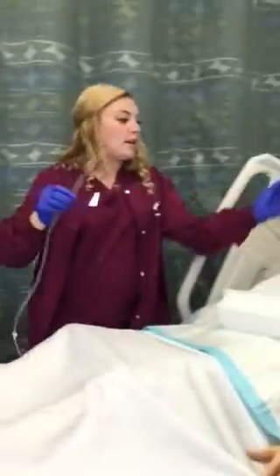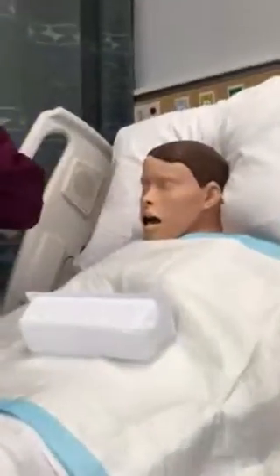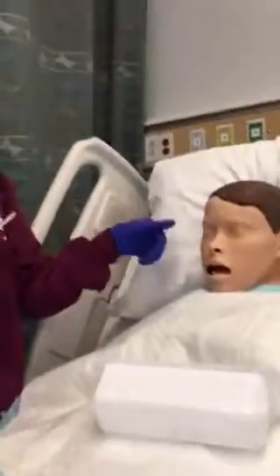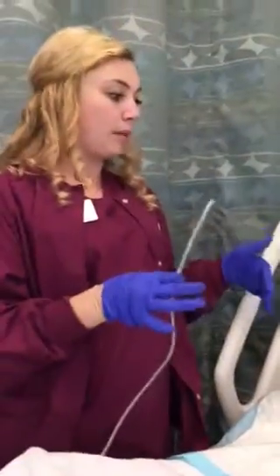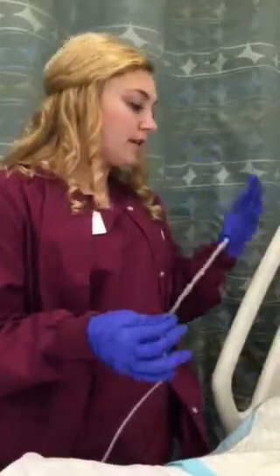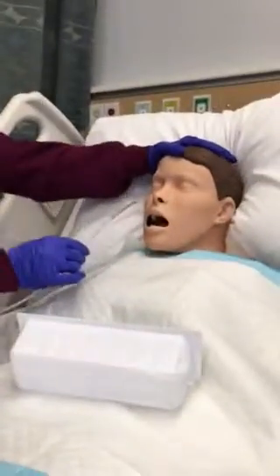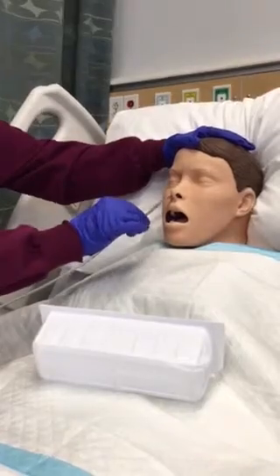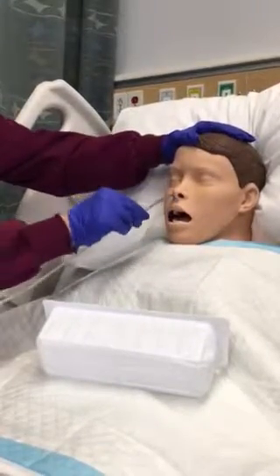Okay. I'm going to have you put your head back for just a minute. And then Erin here is going to give you some water, and I'm going to encourage you to keep swallowing as we do this. You might feel a little bit of discomfort, a little bit of pain. It might burn in the nasal cavity a little bit, but ultimately it's going to make you feel better. So she's going to put her head back. I assessed earlier, and the right naris was bigger and didn't have any lesions.